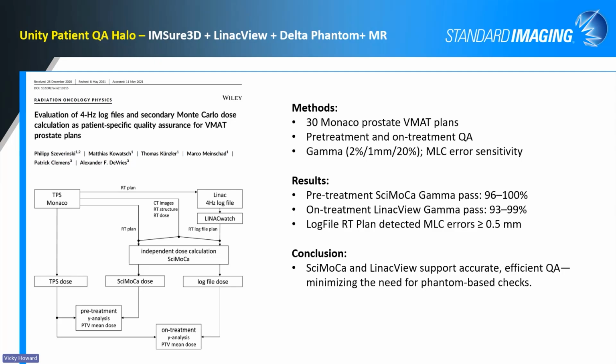And I think both of these things, along with our Adaptivo, I haven't talked about it today, but I will in a future webinar, it's our 2D EPID dosimetry solution. All of those are playing into sort of supporting a new realm of patient QA. I feel that's coming down the pipe. We realize now that there's not value added in doing device-based QA for every single IMRT, for every single VMAT. But as it stands, we are kind of at a point where that's required. However, there is going to be a shift, I believe.